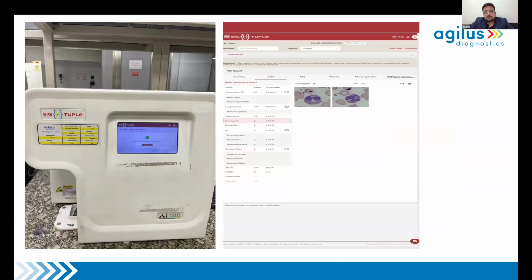So with this, what you understand is that it's so easy for me to not only diagnose my cases, but also take these pictures and show you all. So this is another power of digital pathology in terms of propagation of information.